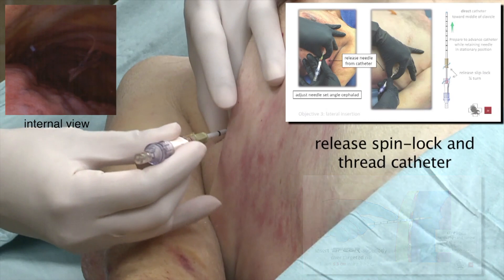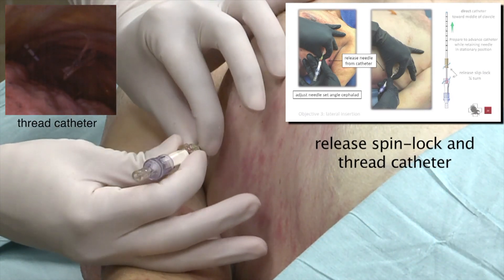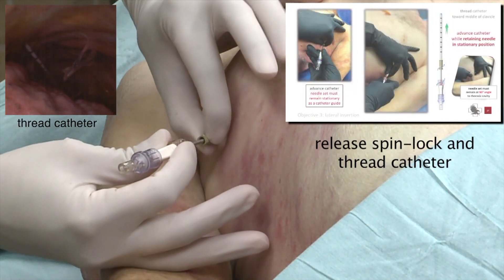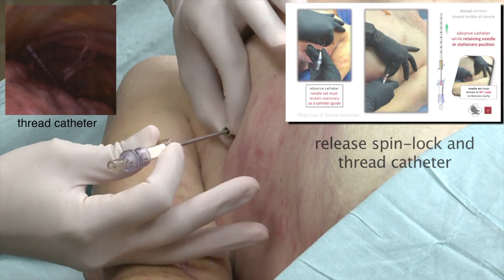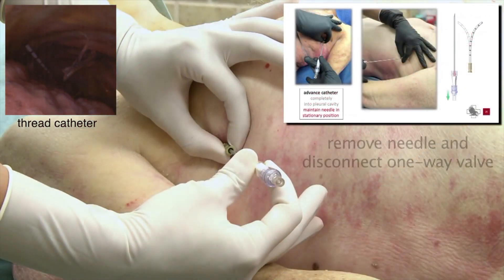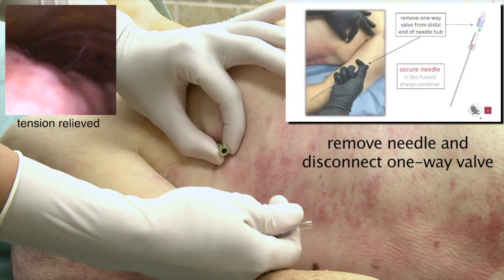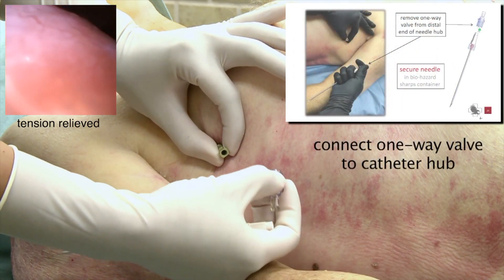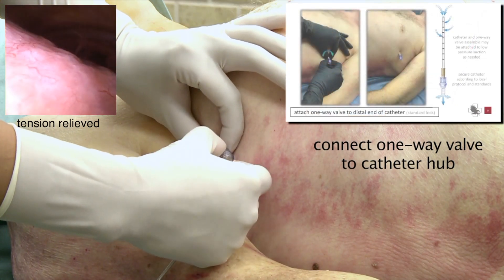Release spin lock and thread catheter over the rib. Remove needle and disconnect one-way valve. Connect the one-way valve to the catheter hub.